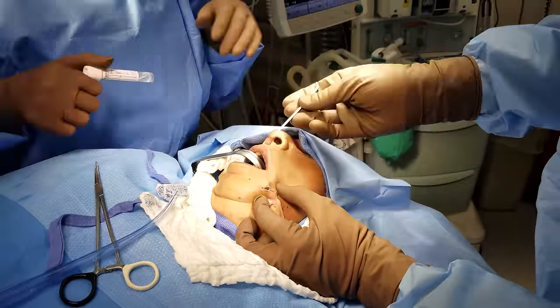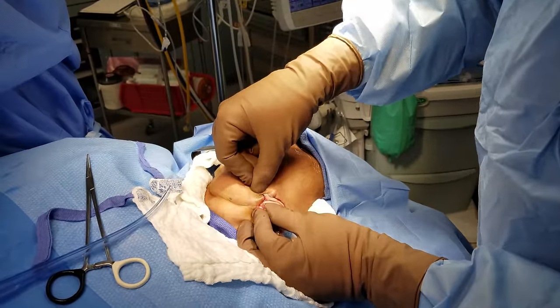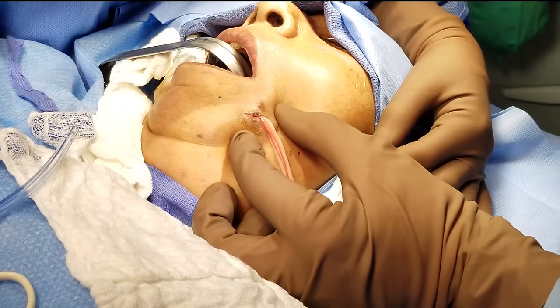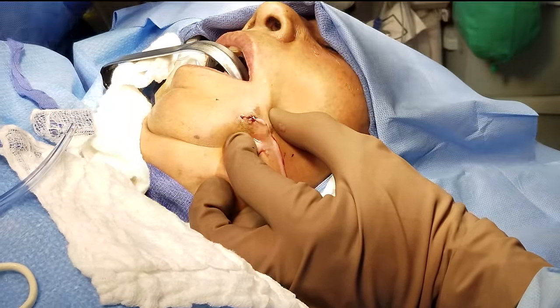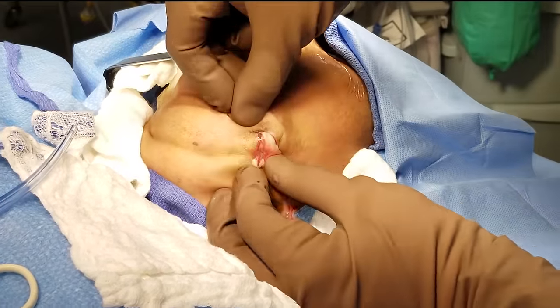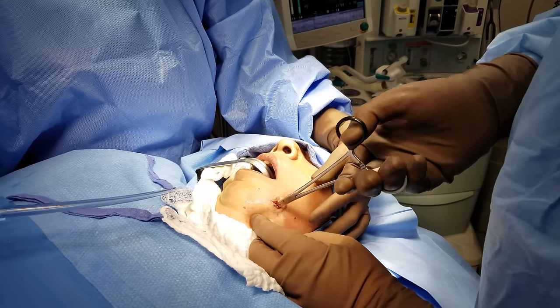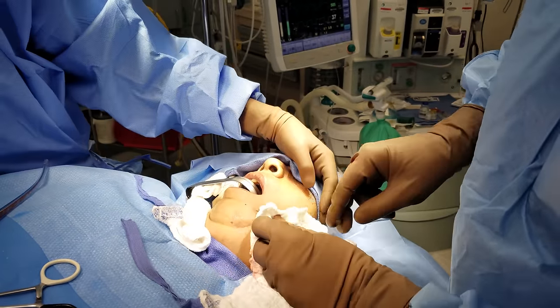Let's get a culture. Okay, now we got to watch that again in slow motion. So here it is, everybody's favorite part of the video. The mandible. Perfect. Okay. Get some irrigation. Thanks. All right.